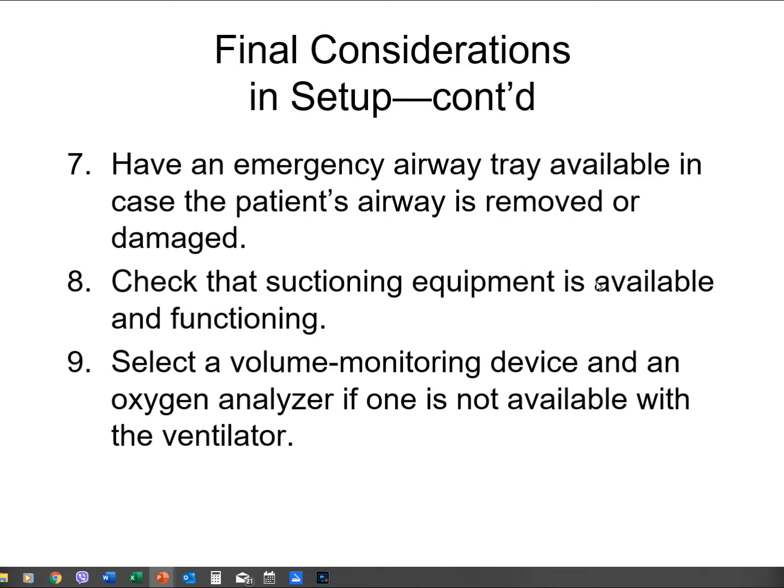Make sure your suction equipment does work. All right. There have been a couple times where I'm prepping to suction, and I use the ballot, I go down, and I'm like, hey, I'm not getting anything, and lo and behold, I forgot to turn on the suction machine. Remember, check the suction machine, and for adults, I believe it's -100 to -120. I think it's centimeters of water pressure. That's for adults. So that's your normal suctioning pressure.